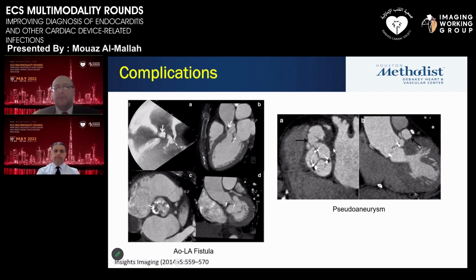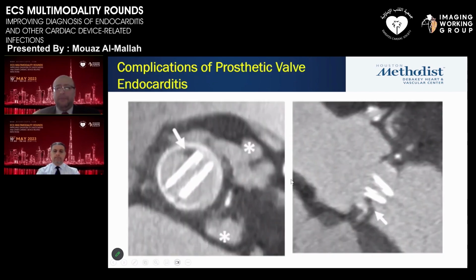And that might have some implications for the timing of surgery if the patient is stable and obviously not decompensated. And that's why we use FDG PET for that. Looking at, for example, endocarditis, looking at prosthetic valves, we are able to see the metallic valves. With echocardiography, you may not be able to see these very well because of all the shadowing that you get.